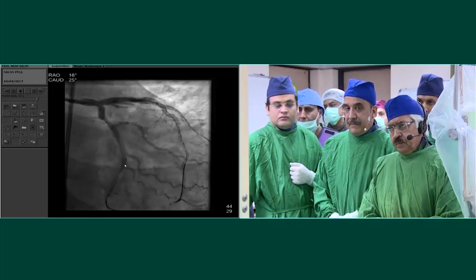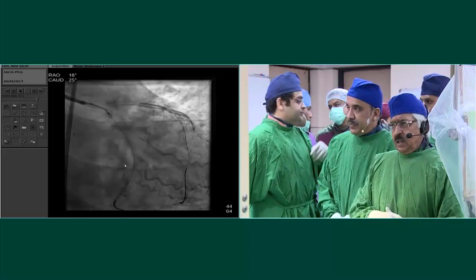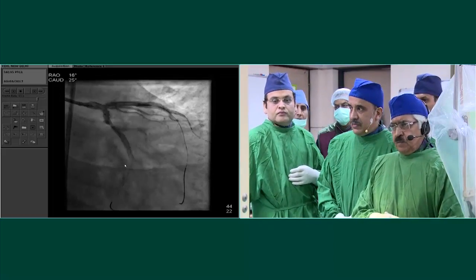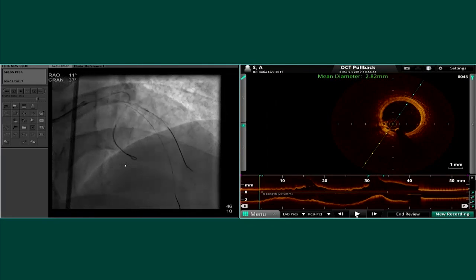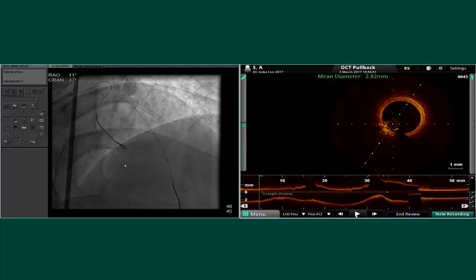Correct? Absolutely. Yes. We have to realize that the scaffold is extending half a millimeter outside its markers. So if we see the marker, it will be half a millimeter. And that's right. Absolutely. And the diagonal is preserved. That's what I wanted to tell you.